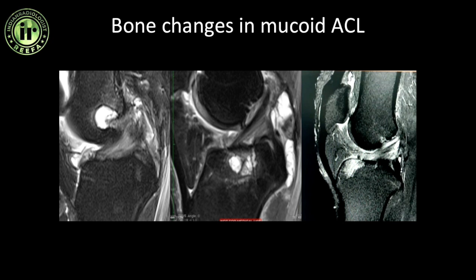In mucoid degeneration, as already discussed, there is accumulation of mucinous material which tends to take the path of least resistance. Sometimes when the ligament itself provides a lot of resistance, this mucinous material enters into the bone, and hence what you get is intraosseous cystic changes. This patient has intraosseous cystic changes at the femoral attachment; here it is at the tibial attachment; and this patient predominantly has small cystic changes along with marrow edema at the tibial attachment of the ACL. When mucoid degeneration or accumulation of mucinous material happens rapidly, it enters the bone rapidly and there is no time for development of a cyst.